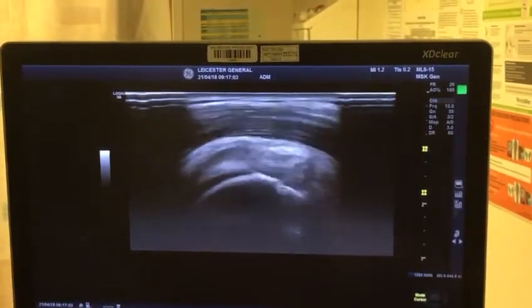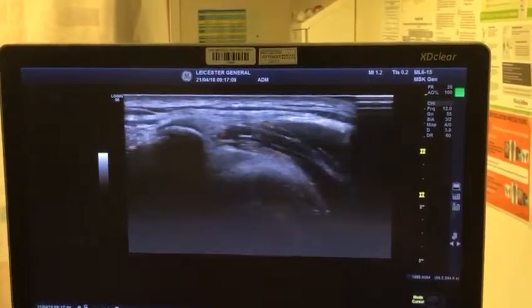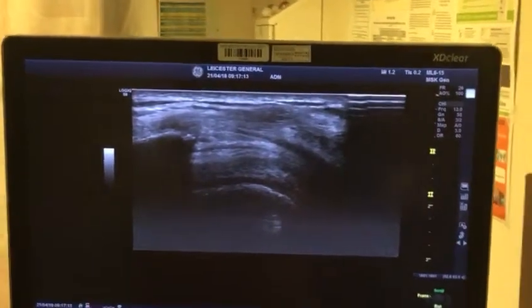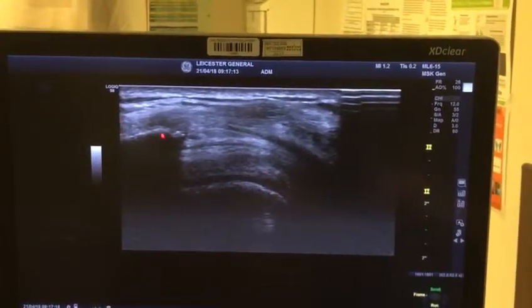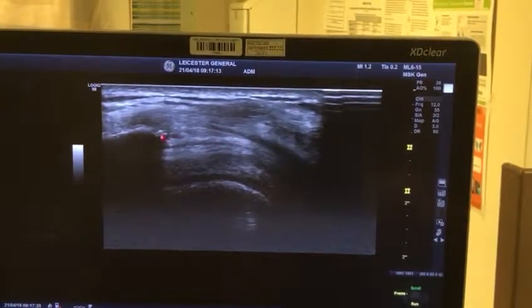Okay, let me just find the acromion. We found the acromion — freeze the image for me. Okay, the structures you see here: that's your humeral head, that's the acromion, and this particular tendon is the supraspinatus.